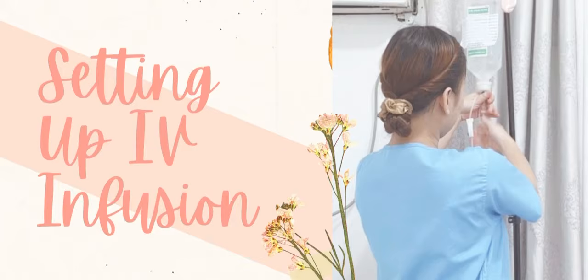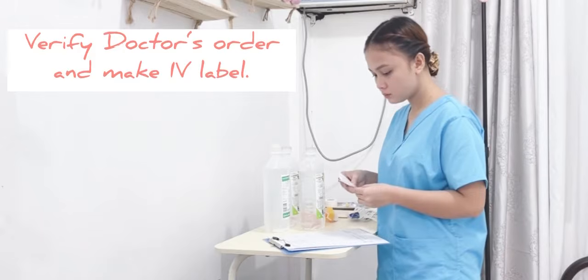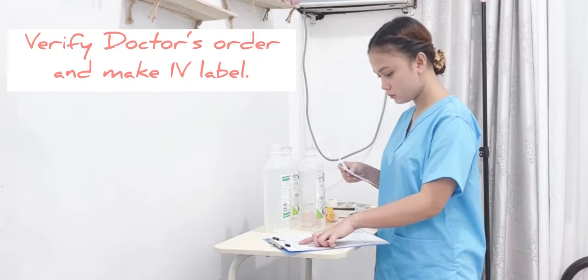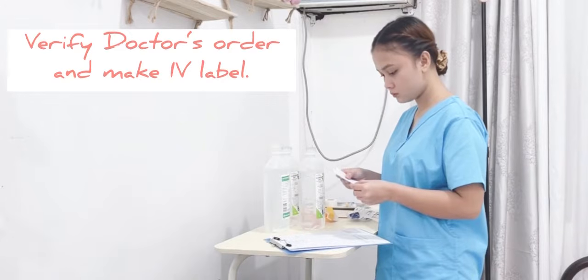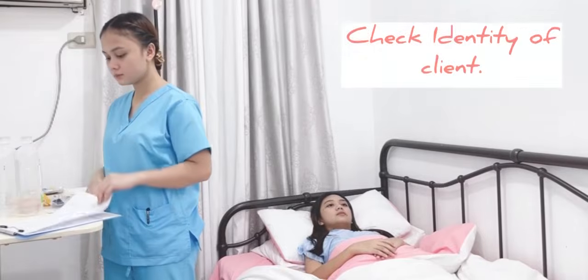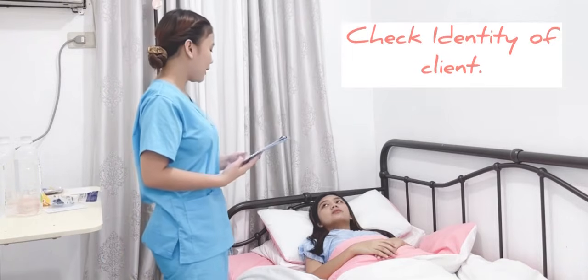First thing is to set up the IV fluid. First thing to do is to verify doctor's order and make IV label. A doctor's order is required prior to implementation of procedures. Then check the identity of the patient. It ensures correct solution to be administered to the correct client.